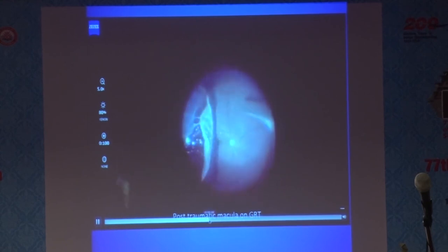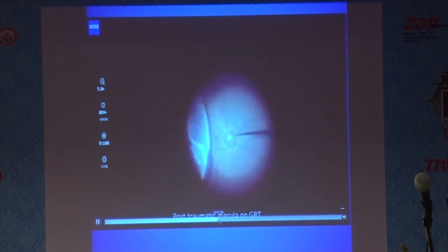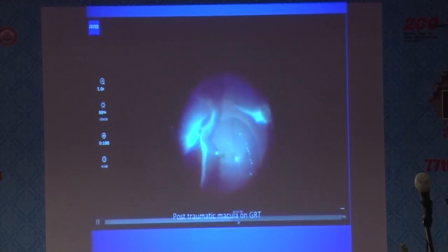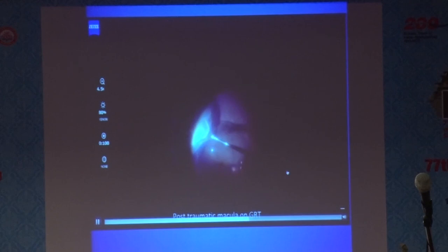In this situation, once you inject the PFCL, just keep it posterior to the posterior flap, because that will act as a third hand and it will facilitate the peripheral base dissection. After this, the standard steps are completed like I had shown in the previous surgery. For want of time, I'll just skip this video.